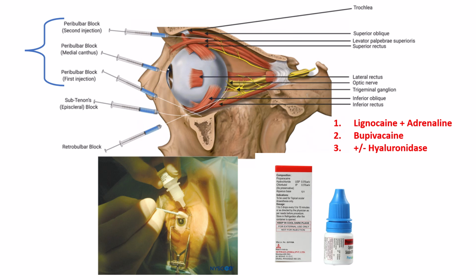With the advent of phacoemulsification, we have started using topical anesthesia, which consists of proparacaine drops, which are just instilled into the eye a few minutes before the surgery, and it provides you analgesia. Akinesia is not provided, so the patient has to be cooperative.